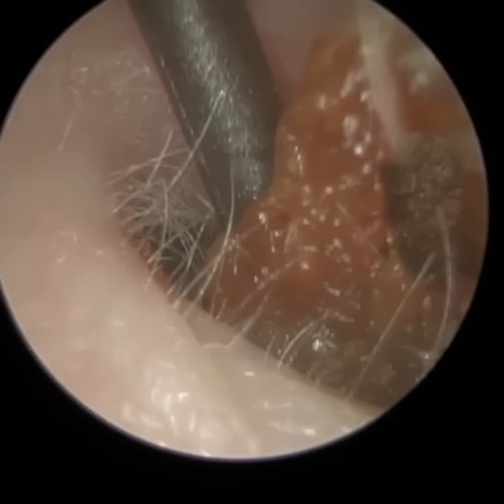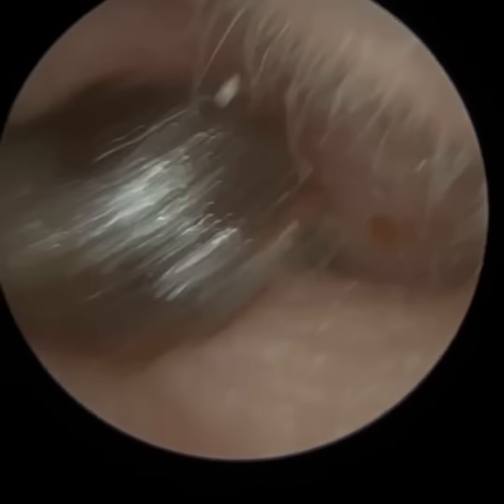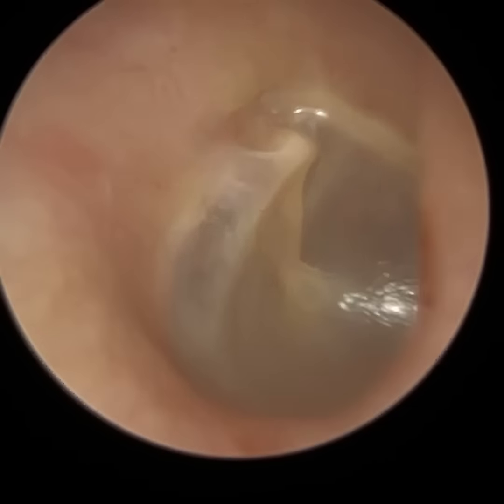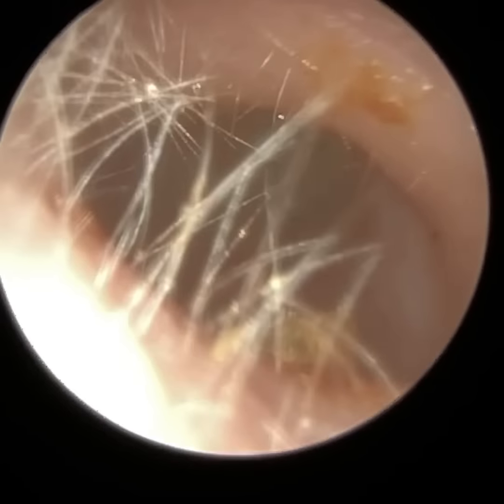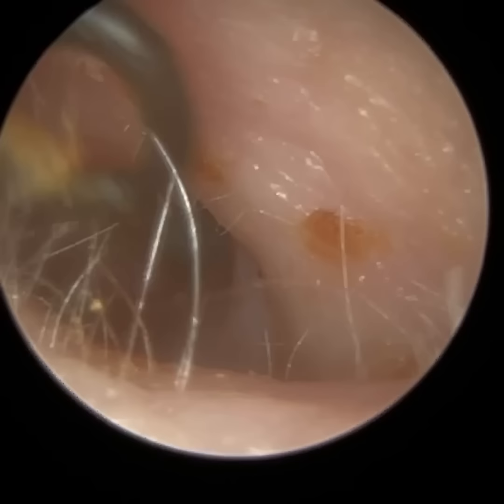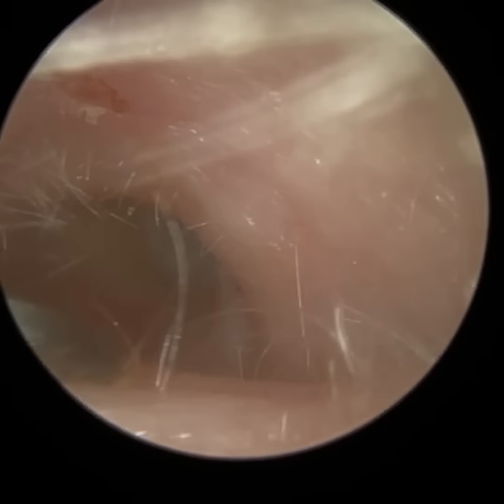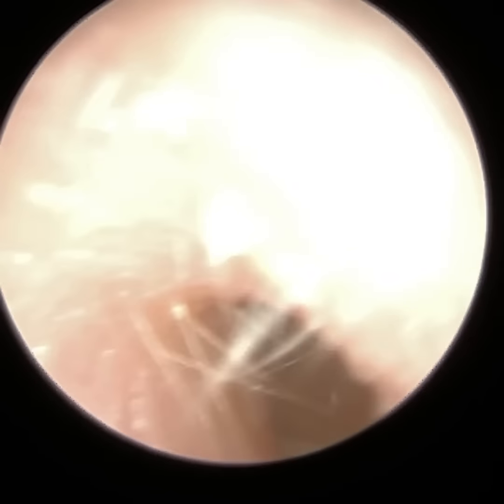So you enter the ear going slightly to the right, then you turn left at that first bend, and then you turn right again at the second bend. The patient's eardrum is intact, but they have got an attic retraction, and their posterior malleolar fold — which is where the pars tensa of the eardrum, the tense section, connects to the pars flaccida, which is the more elastic, flaccid part, hence the name pars flaccida.